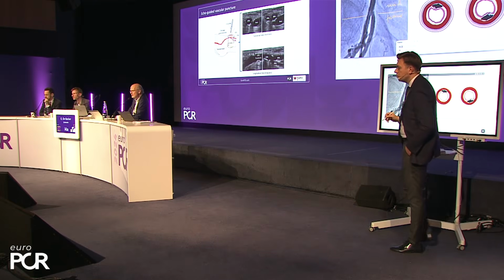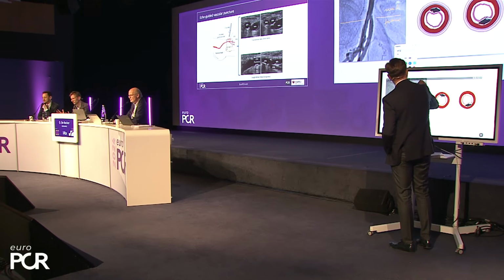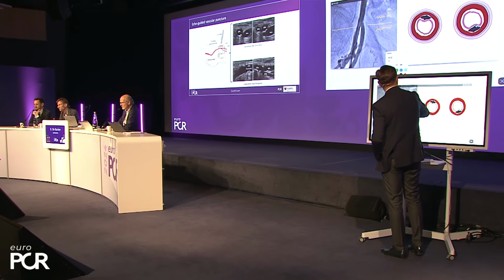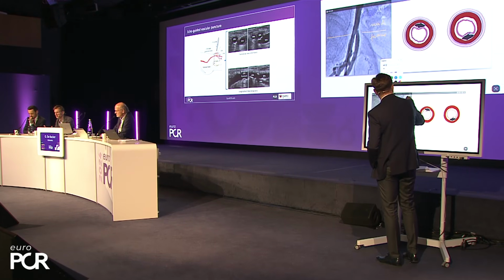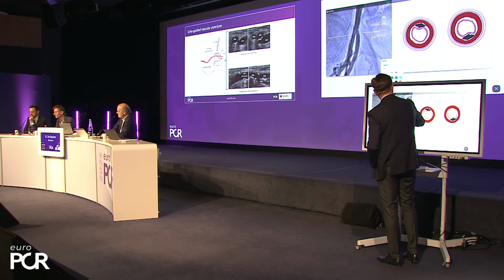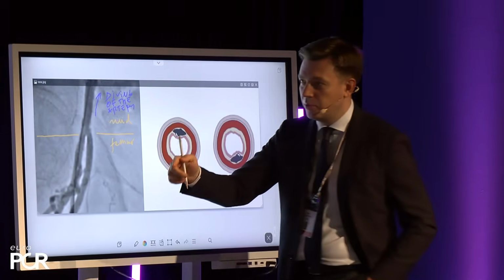I mean, if you want to do your cases in local anesthesia, as more and more centers want to do their TAVIs in local anesthesia only, as we do in Copenhagen too, it makes your anesthesia just better and more effective to give it under echo, instead of giving it blind, that's for sure. So let me just emphasize that before we come.